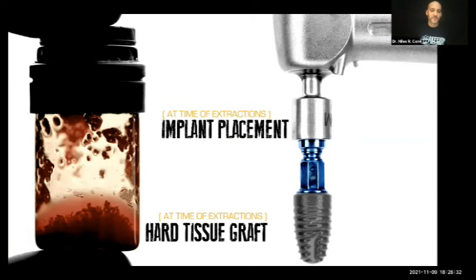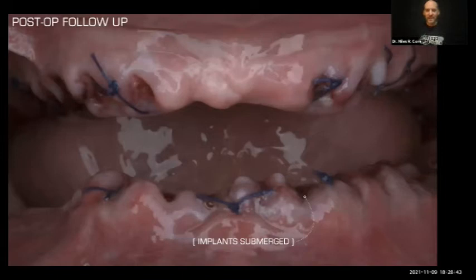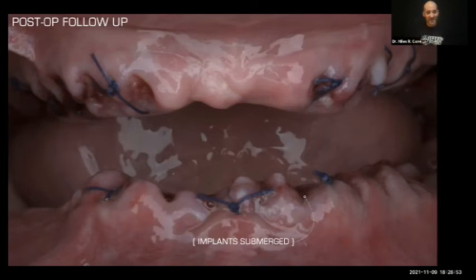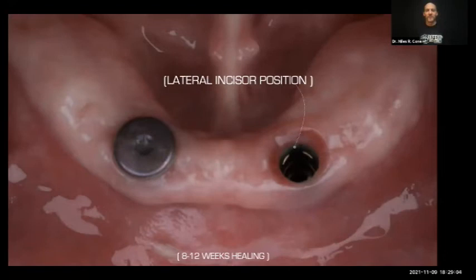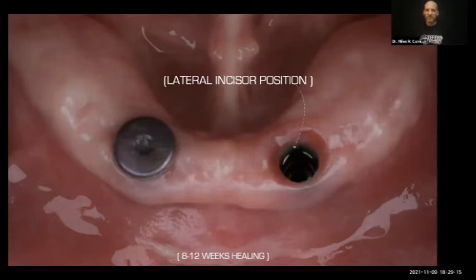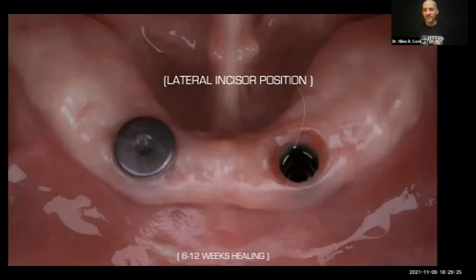Someone asked last time about immediate load for locator overdenture cases — no, I don't do immediate load. I submerge them and let them heal until the surgeon says we're good to go, usually somewhere in the range of two to three months. The lower anterior mandible has one of the highest implant success rates — the bone is so dense, I almost never see implants fail there. At about two to three months, I take the healing abutments off and you see that nice cuff of healthy tissue around there. Some bleeding is totally okay — it means the hemidesmosomes are starting to attach to the titanium.